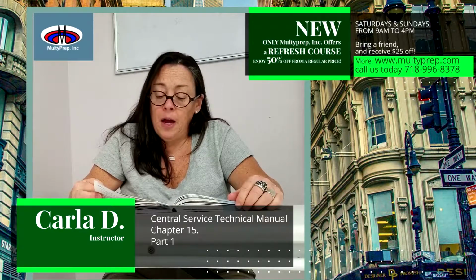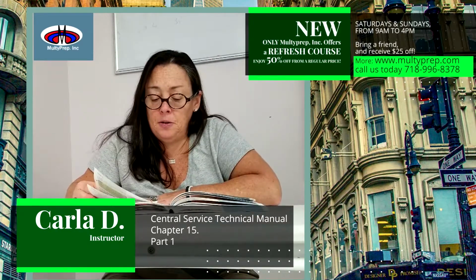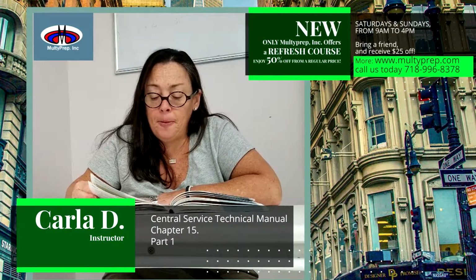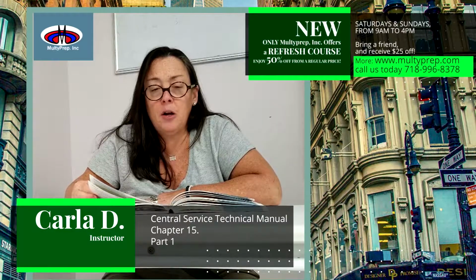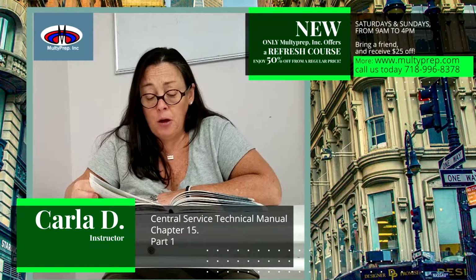Exposure monitoring. EtO, which is ethylene oxide, has been widely used as a low temperature sterilant since the 1950s. It has potential health risks and requires monitoring, long aeration times, and other precautions. While safer for healthcare workers, newer low temperature sterilization technologies also can pose health risks.